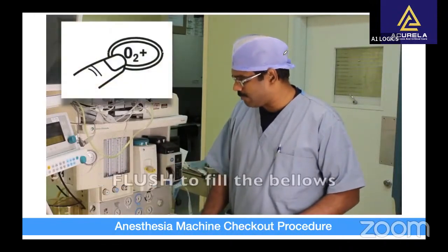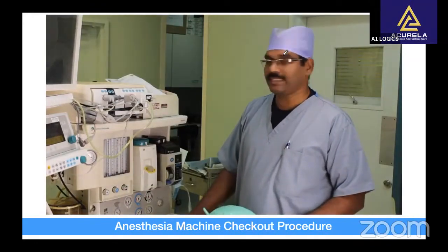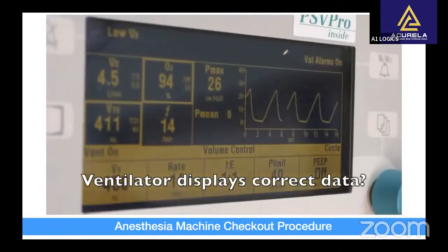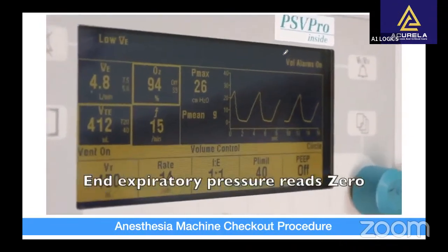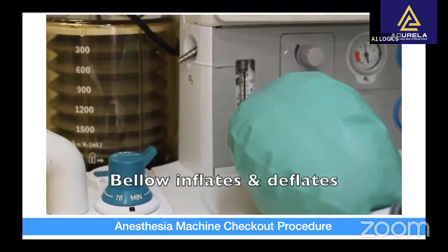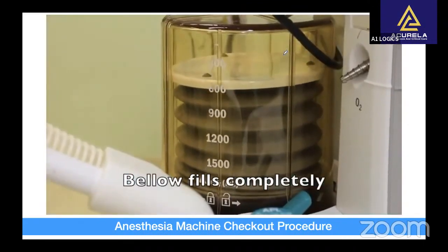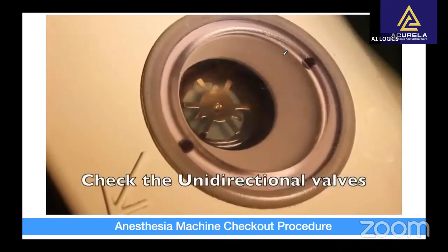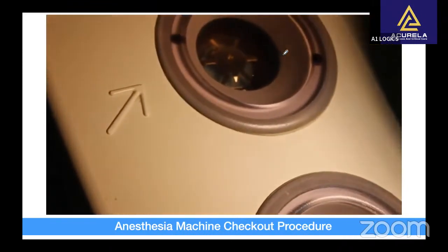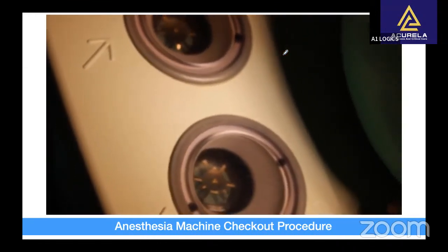Using the flush, fill the bellows, and now the machine ventilator starts. Check whether the ventilator displays correct data. The end expiratory pressure should read 0. Note that the bellows inflates and deflates, and check whether the bellows fills completely. Check the correct operation of unidirectional valves. The inspiratory valve rises on inspiration and falls in expiration. The expiratory valve rises in expiration and falls in inspiration.